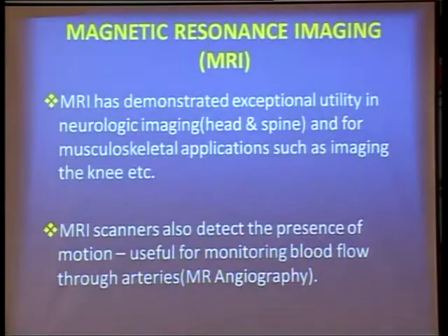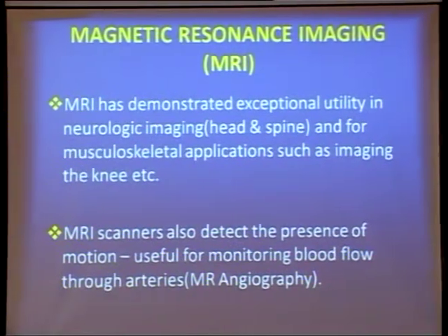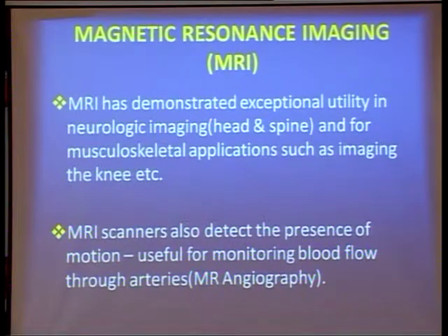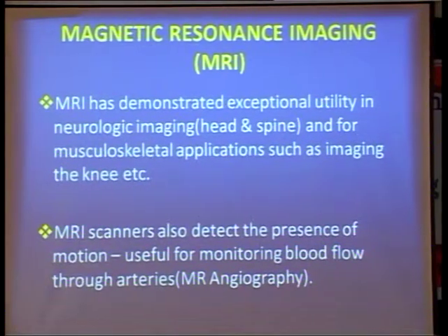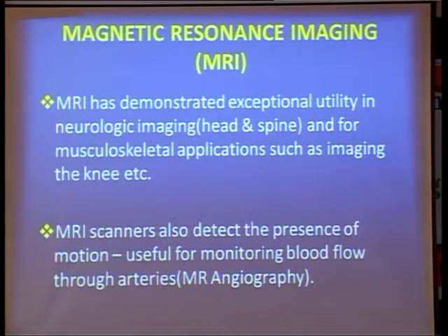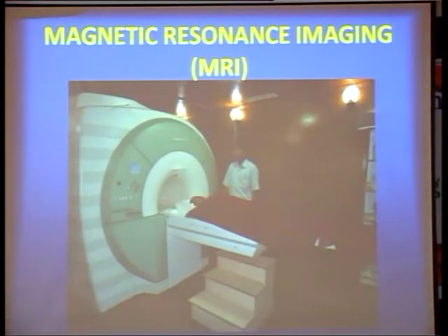Next one. Magnetic resonance, some other speakers are also going to touch on this. MRI demonstrated exceptional utility for images first. First they implemented only the scanner, the MRI scanner. But in 1972 to 73, at one general hospital, there was one scanner doing only low-field scanning. After this, a whole body scanner was developed. Next one. This is the MRI scan.